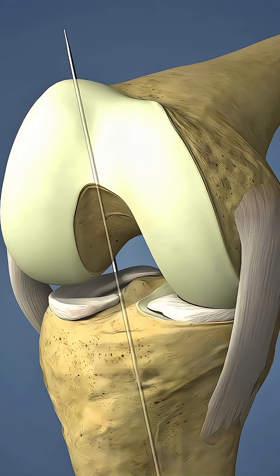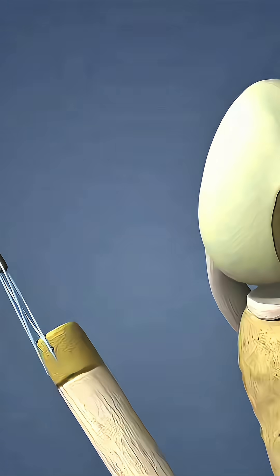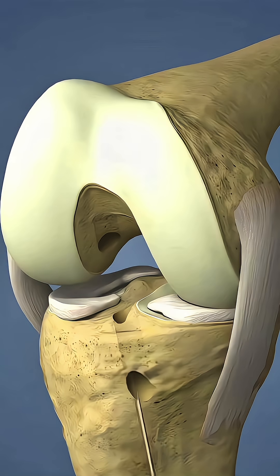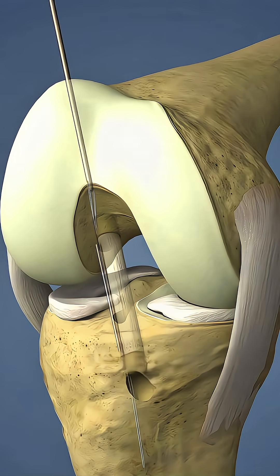Tunnels are drilled in the tibia and femur at anatomical ACL footprints under arthroscopic guidance. The graft is passed through the tibial tunnel into the femoral tunnel and positioned to mimic the natural ACL.